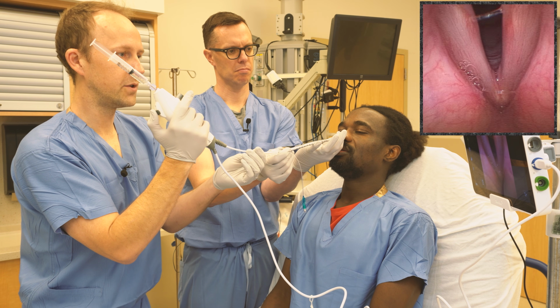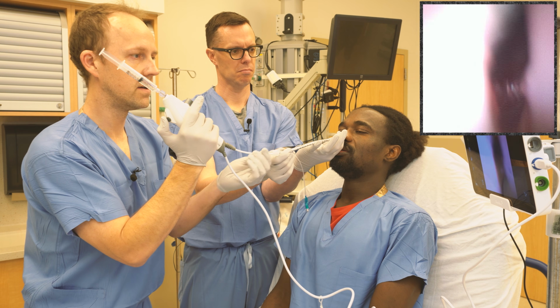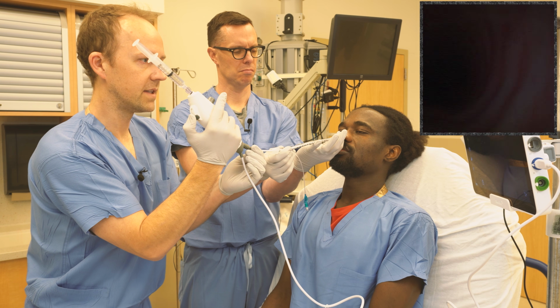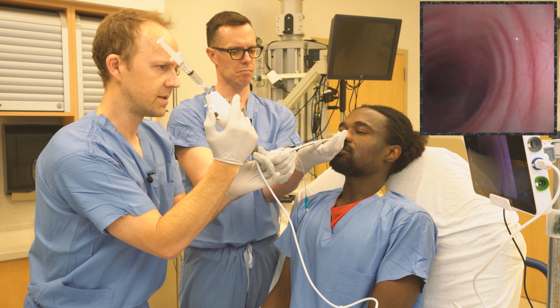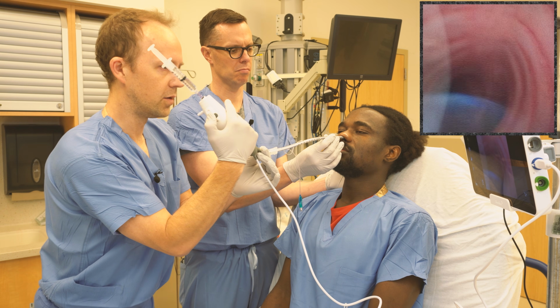So now we're between the vocal cords, and go ahead and breathe in. Okay, now we're in the trachea. You can advance the scope down the center of the trachea to near where the carina is. And then at this point, your assistant can advance the tube gently over the scope.